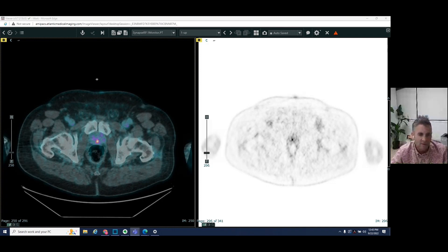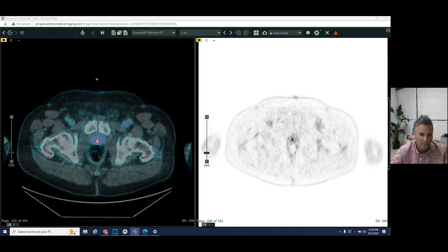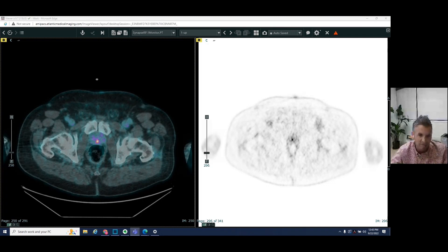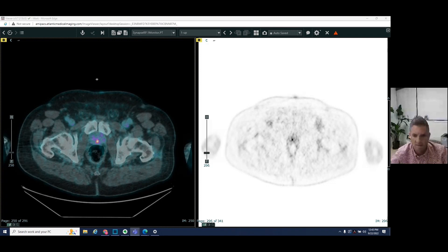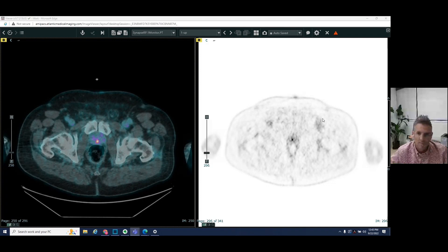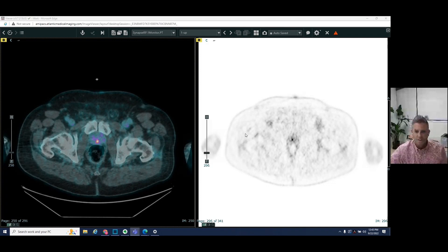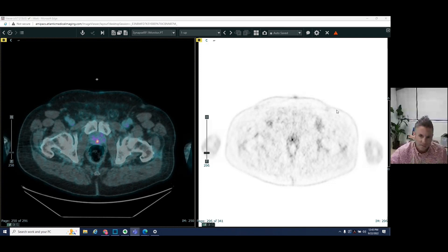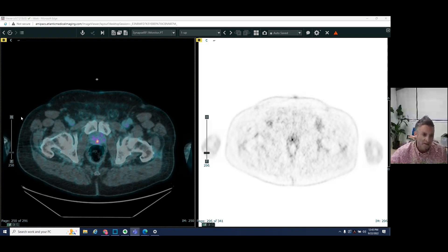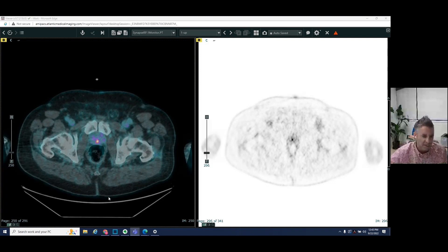And so if it lights up on the PET CT, it tells us that we have recurrence of prostate cancer. So image on the right here is a PET image. Image on the left is a fused CT and PET image.